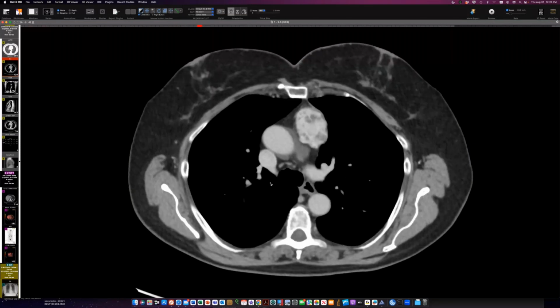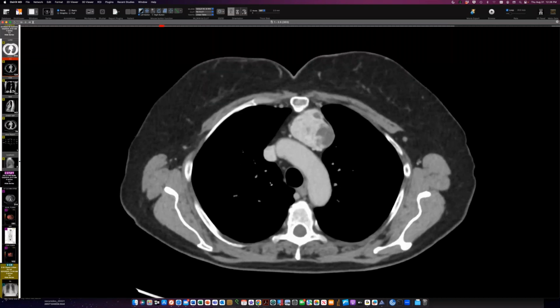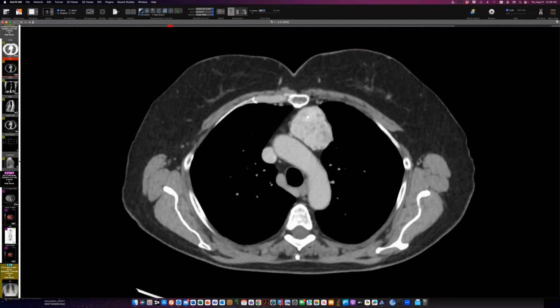Okay. So top choice paraganglioma? I like paraganglioma. Yep, okay. That's where I'd put my money, just based on the imaging. So they popped it out, and Jeff was right at the beginning. It's ectopic thyroid. Oh, really?